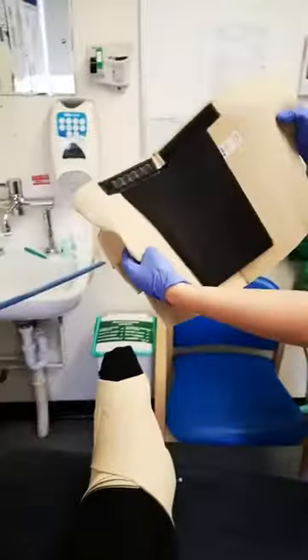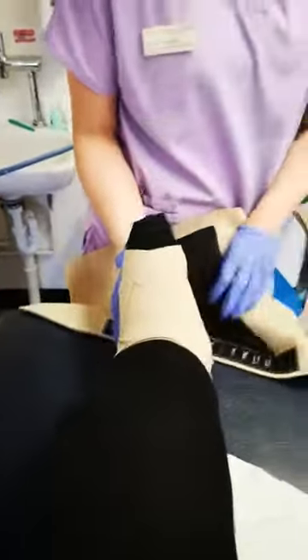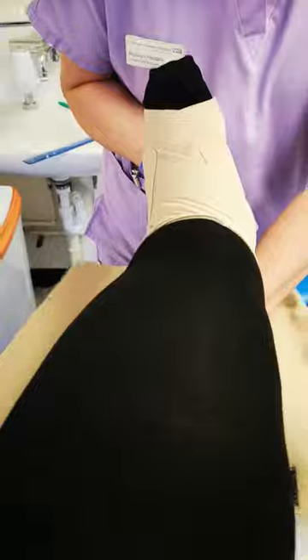So this is the leg wrap. We're going to put this underneath the leg — it might be easier to do this in the bed where it's flat. This will go directly under your calf like so.